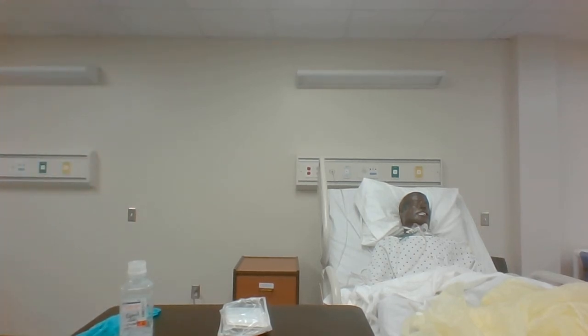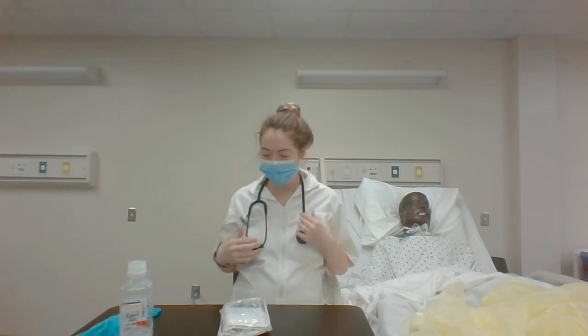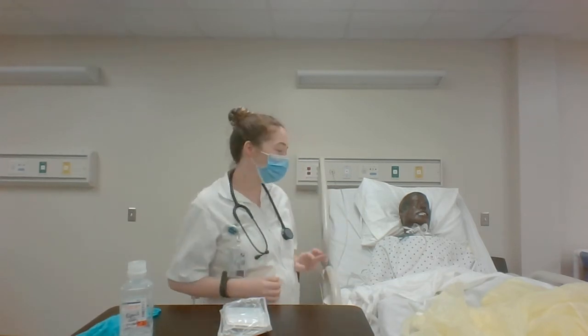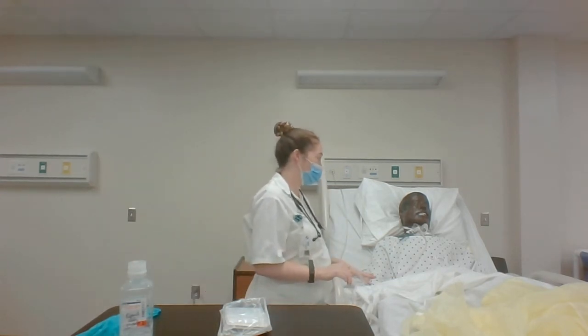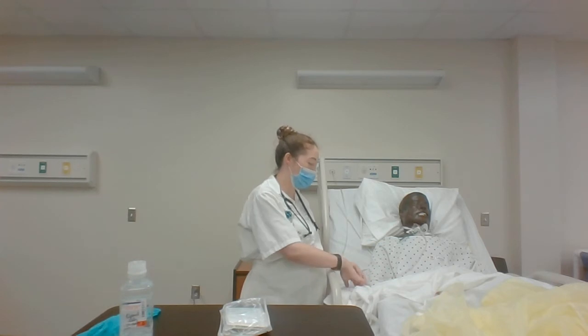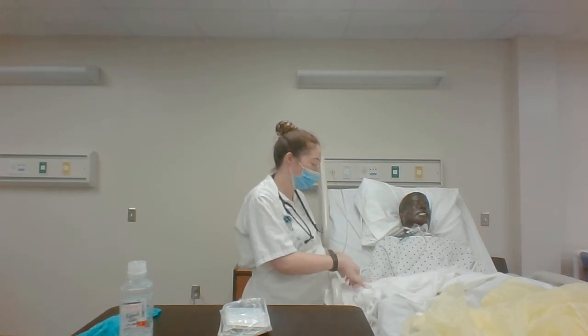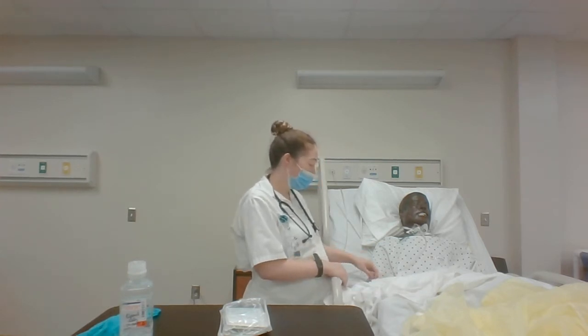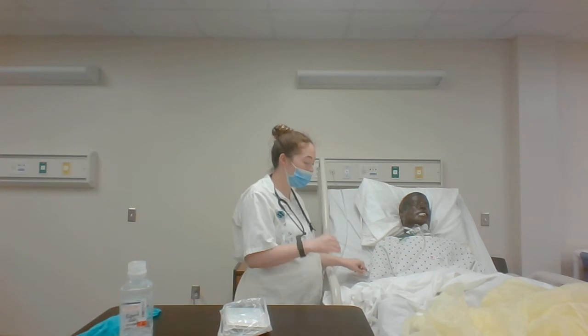My name is Madison and I'm going to be performing trach suctioning. First, I would identify my patient and verify my physician's orders. I would identify my patient by two patient identifiers and verify my patient's allergies.